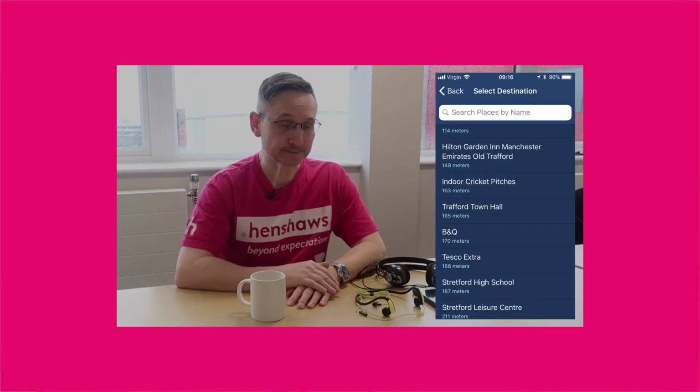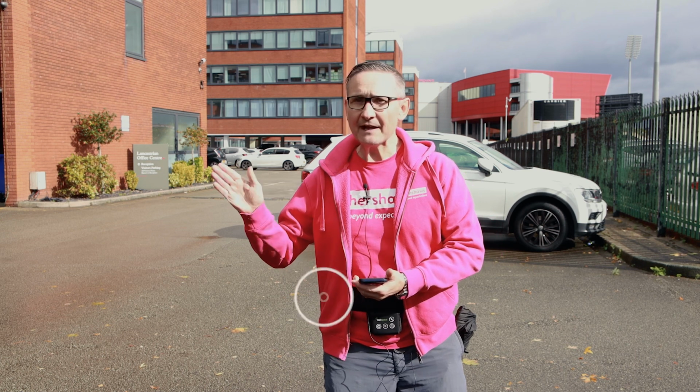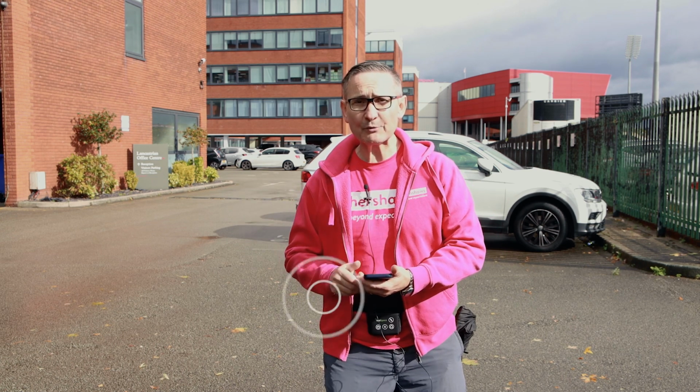Okay, so let me tell you a little bit about the naviBelt from feelSpace, which is a company in Germany. It's a little bit like Soundscape. If you've not seen that video, check it out. The way it works is the belt itself is worn around the waist. I tend to wear it just above the waist, and it's got little vibration pads all the way around the belt, literally 360. And these pads vibrate depending on which way the routing needs to take you.